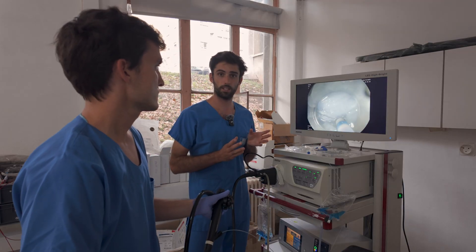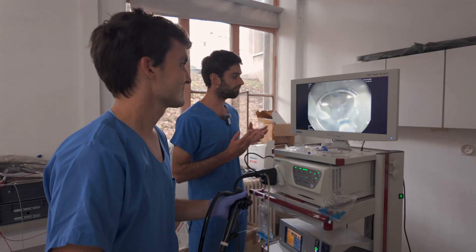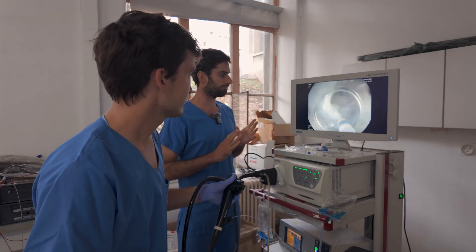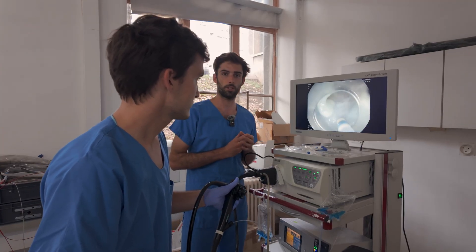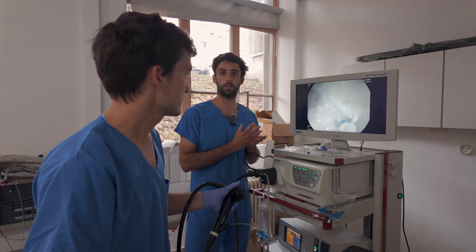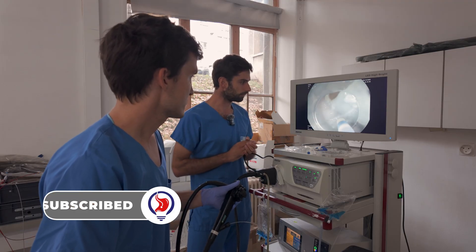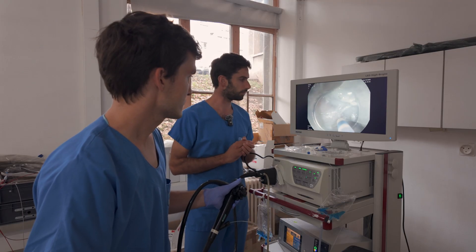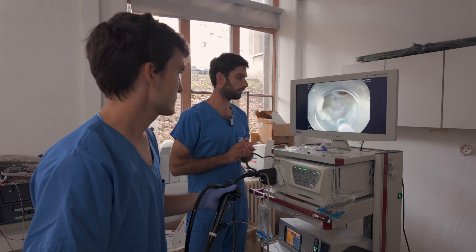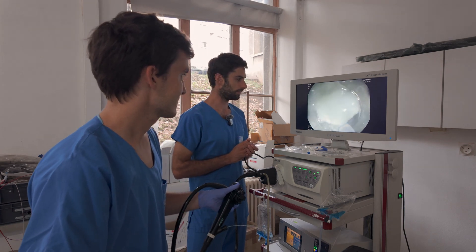The second major aspect is research. Aluijan is at this very moment creating a precisely controlled lesion as part of a comprehensive research protocol we've recently launched, which is specifically designed to evaluate a newly industrialized traction device compared to more conventional dissection methods, all conducted in a strictly randomized manner. Typically for his return from vacation, he started with a lesion without traction, which was quite difficult, and now he's managing with traction, even if it takes a bit of time.